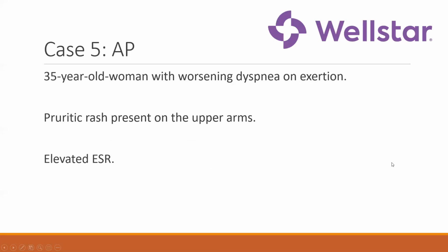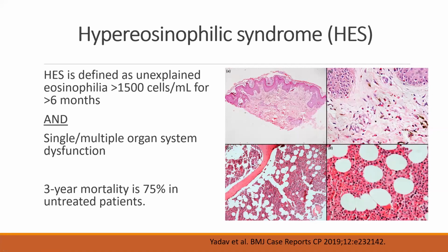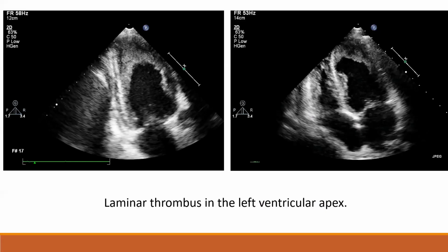Moving on to our fifth case. This is a 35-year-old lady who has worsening dyspnea on exertion. She also has a pruritic rash on her upper arms. Laboratory values show an elevated SED rate. This patient on echo has a laminar thrombus in the left ventricular apex. This is a very rare finding, but characteristic of a specific diagnosis, which is hypereosinophilic syndrome. This is a very unusual finding, and when you see it, it's quite alarming.